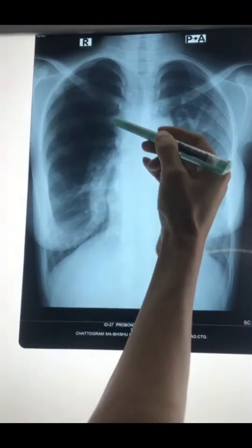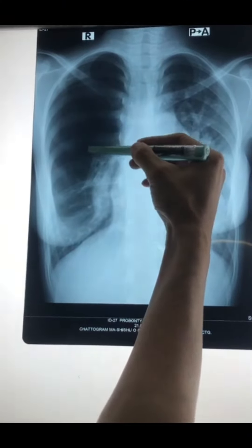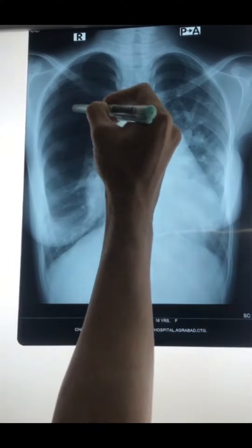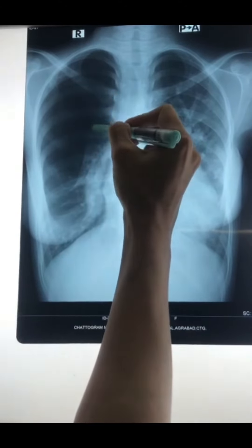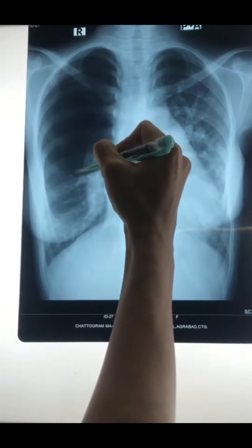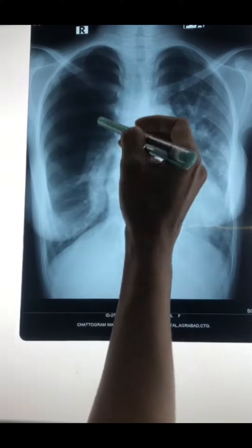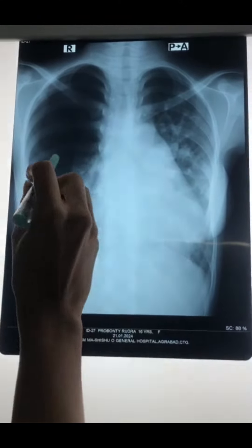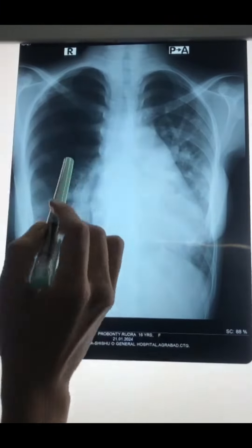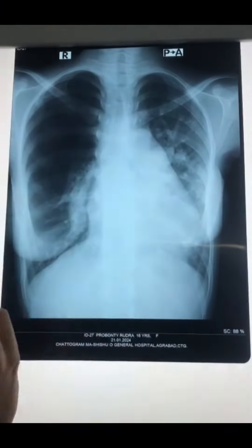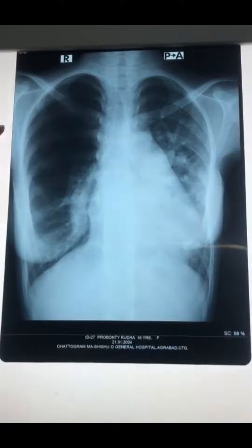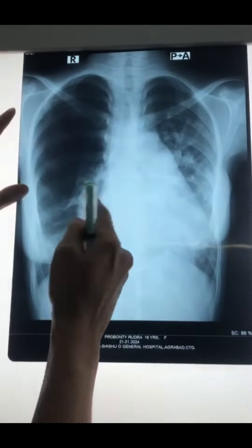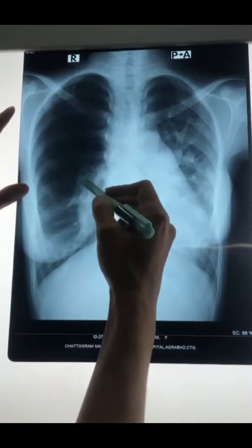Here we are just reading the density of the lung fields. Here we are using the pleural space and the right lung. The right lung has collapsed. This is the hyper-translucent shadow with collapsed lung margin. This is the right side of the chest.